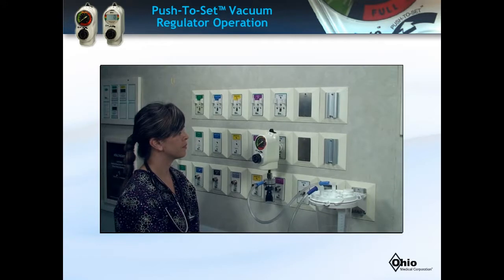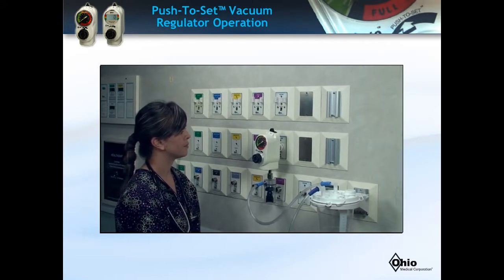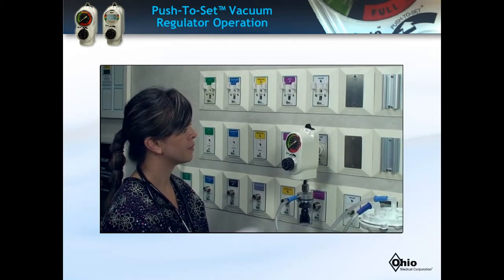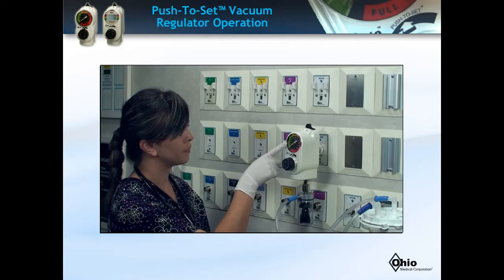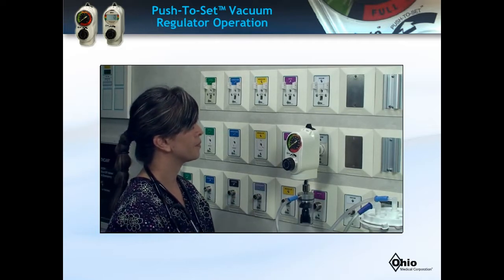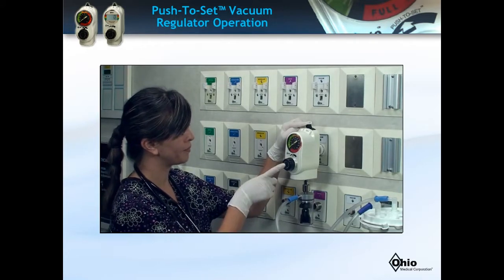Lastly, we will demonstrate how you will operate your Ohio Medical push-to-set vacuum regulator. First, let's review the parts of the push-to-set regulator. The vacuum gauge will be either analog or digital depending on the model your institution purchased. Here is the Mode Selector switch, and here is the suction control knob.